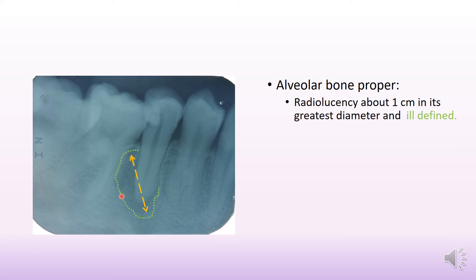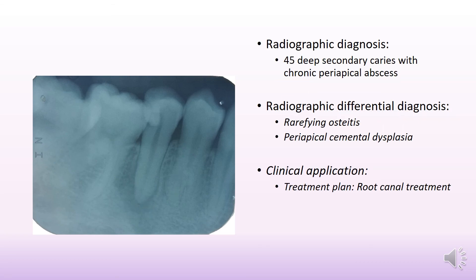For the alveolar bone proper, the radiolucency is fairly irregular, which is why we use the term ill-defined. In its greatest dimension the diameter is around 1 cm in size. Using the known root length of 14 mm as reference, this radiolucency would be around 10 mm, equivalent to 1 centimeter.